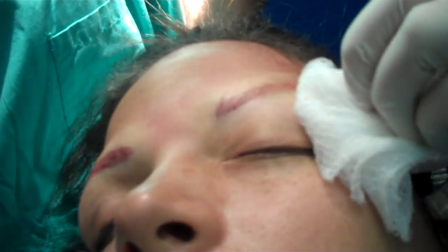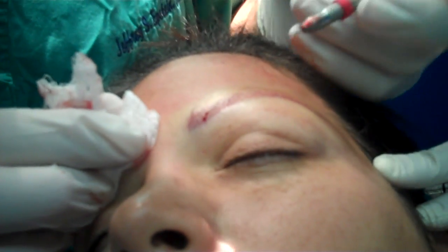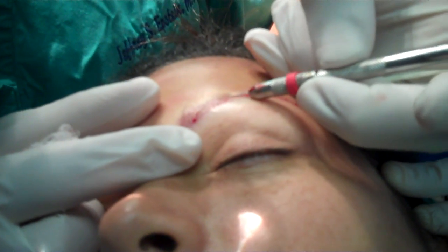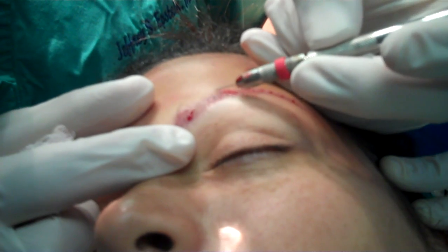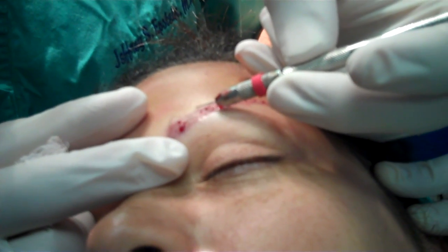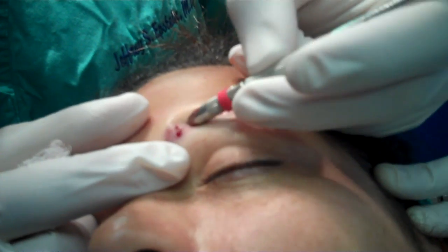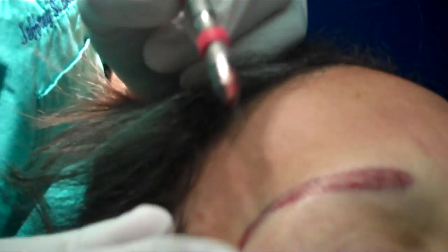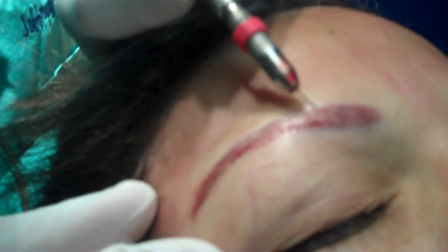Now we'll start planting those grafts, and then I'll come back and make some more to further round it out and make it more even. I can see already that we're going to need to bring this one up just a little bit — but that'll be better assessed once the patient is sitting upright and we have this initial round of recipient sites already planted. You can see on this side that I've already done, there's a more completed look — these hairs growing upwards, these hairs growing downwards, and that's how it works.